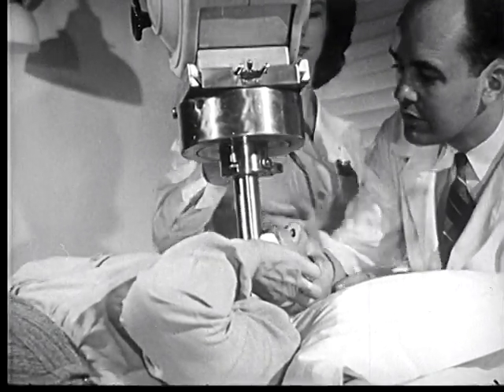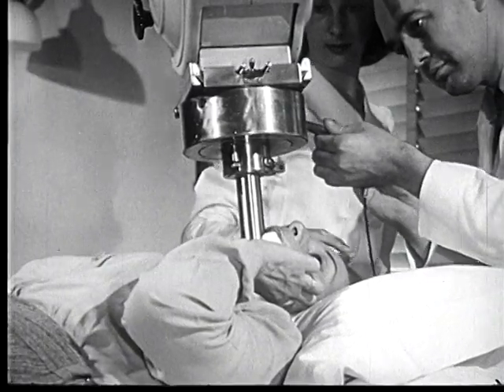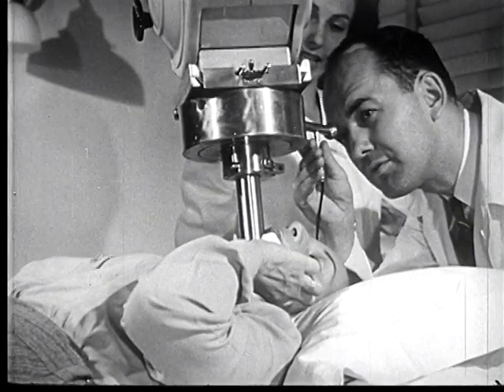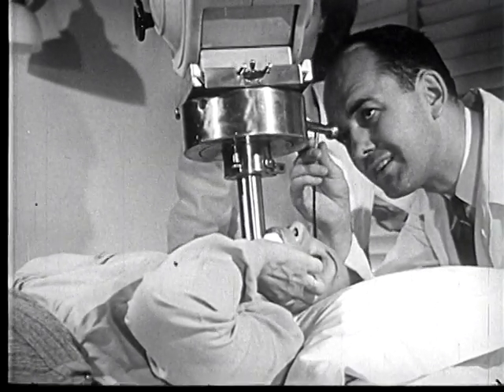The position of the cone is accurately checked by using a periscope. With it, the doctor can see if the malignant area lies in the path of the X-rays directly under the cone.